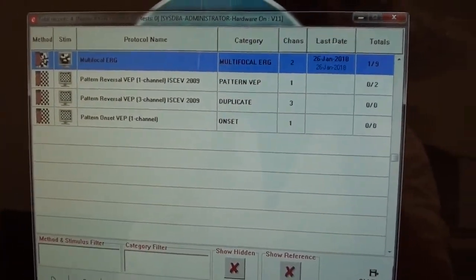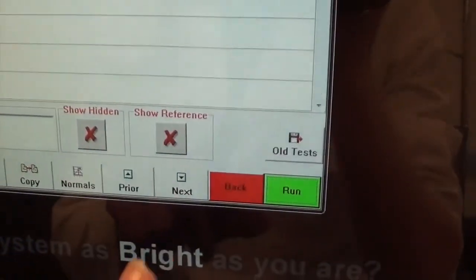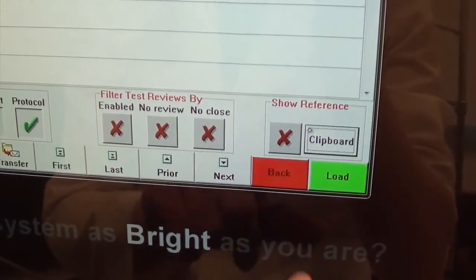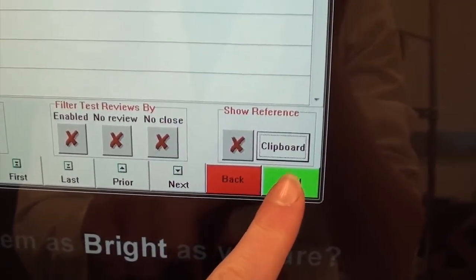To view the test, click old tests and load it.